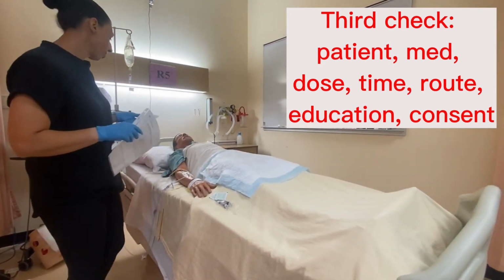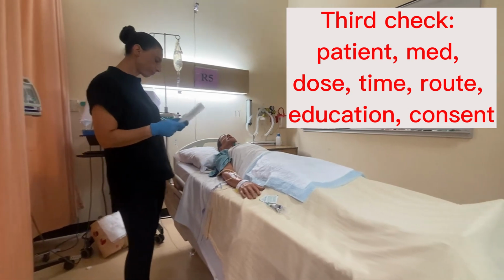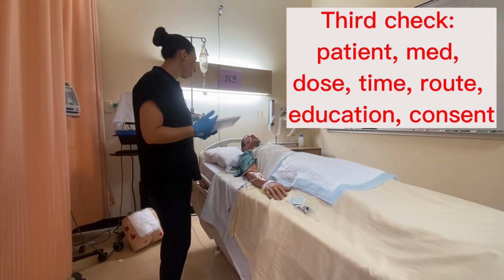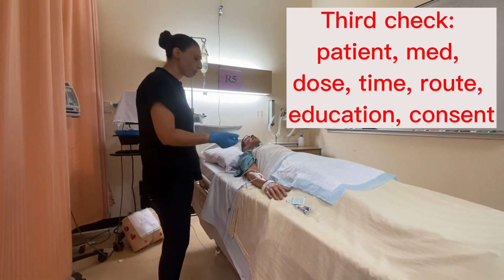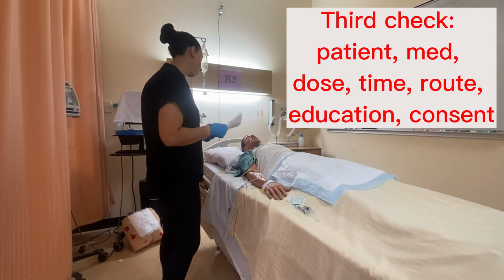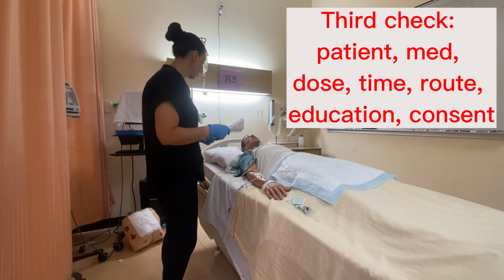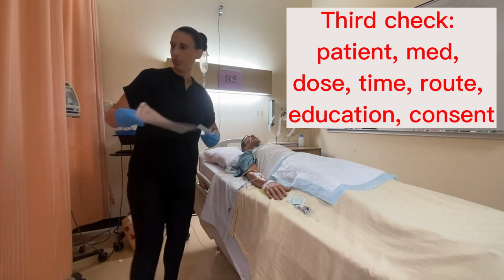Now, Parsio, I'm just going to let you know about morphine. It's an analgesia for your pain. You might feel a little bit dizzy or nauseous. I'm going to put your call bell next to you so you can call me if you have any concerns or reactions. Do you consent to this medication? Of course, you'll say, yes, please give me the medication.